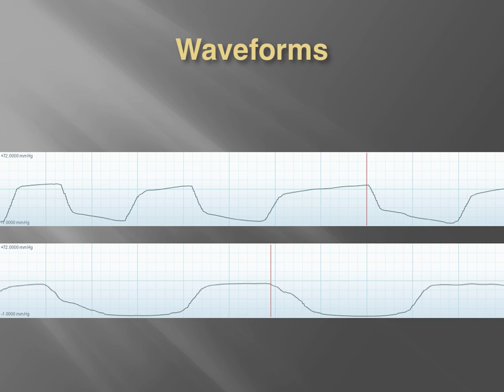So these waveforms may look relatively normal, and I wouldn't normally get too upset about them, but there is something to remember here, okay? First of all, relatively good rate, nothing to get too worked up over. Relatively good levels, around 35 or so, and a relatively good waveform. However, what's going on right here?